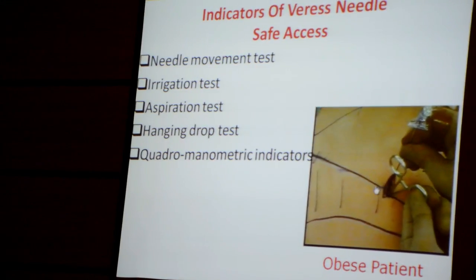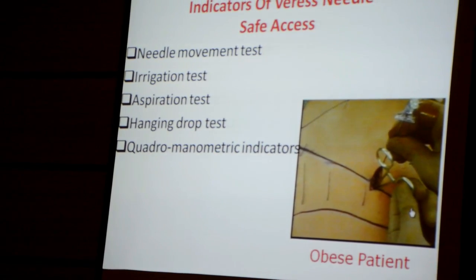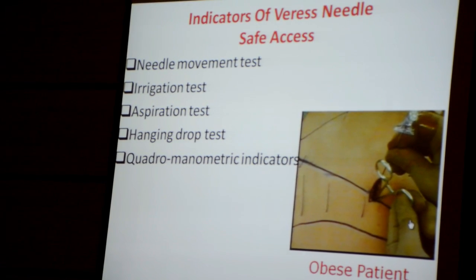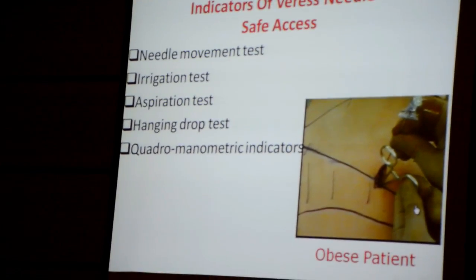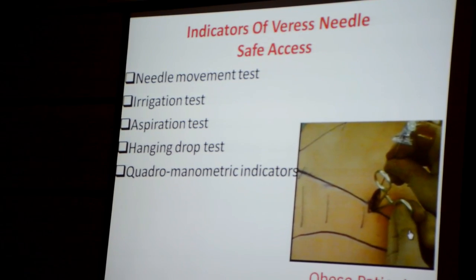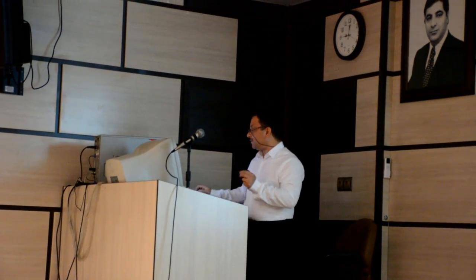We make an incision here, and then with cautery instruments we dissect the fatty tissue until we reach the sheath. We grasp the sheath and pick it up. You will not see the skin bulging, just the sheath coming up. The skin is normal, and then the sheath comes up and we insert the Veress needle. It is a very easy technique, and we can avoid many injuries during this procedure.